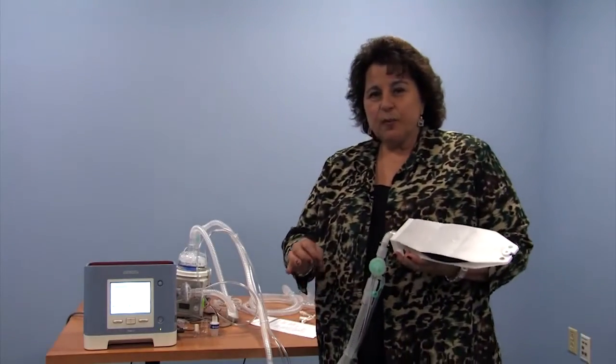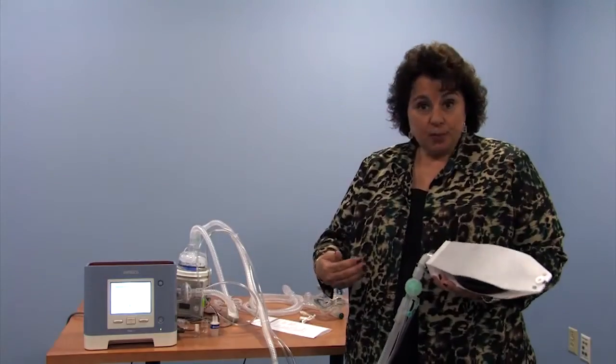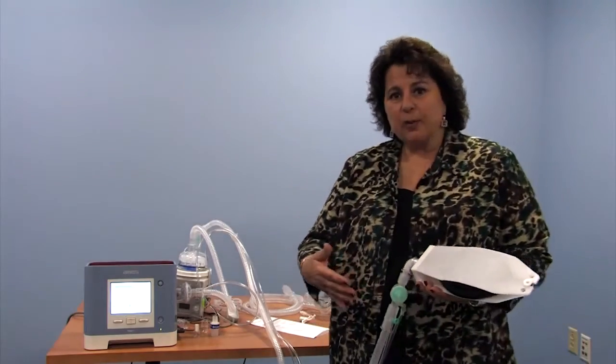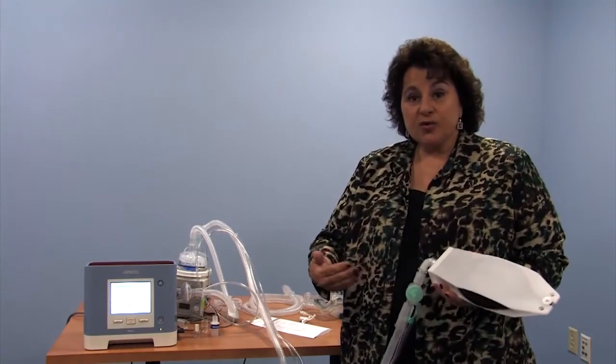Another situation in which you might see this is if the child has an uncuffed tracheostomy tube or a tracheostomy tube that the cuff is not inflated during sleep. The larger the leak out the nose and mouth, the ventilator may, if not set properly, the sensitivity not set properly, may what we call auto cycle or auto fire breaths. So please do consult with your DME, durable medical equipment company therapist, and/or whoever's following your child about potentially adjusting the ventilator's sensitivity so that it doesn't do this auto-cycling phenomenon.